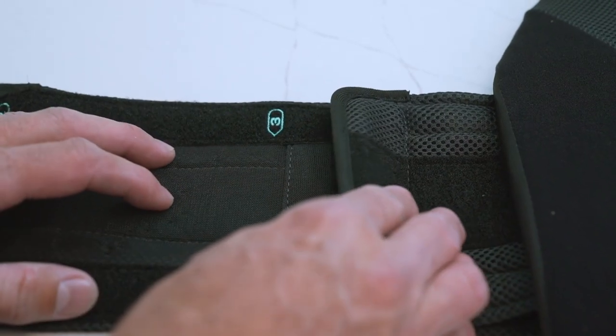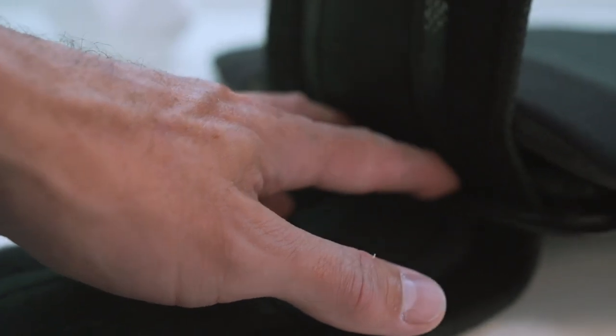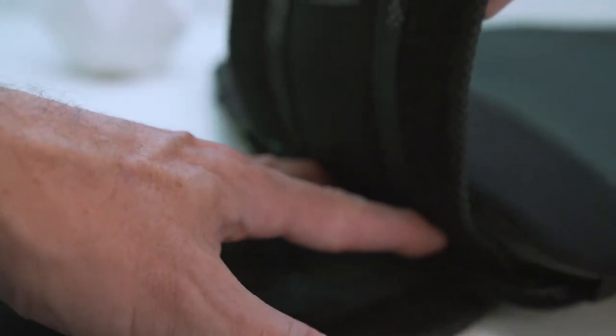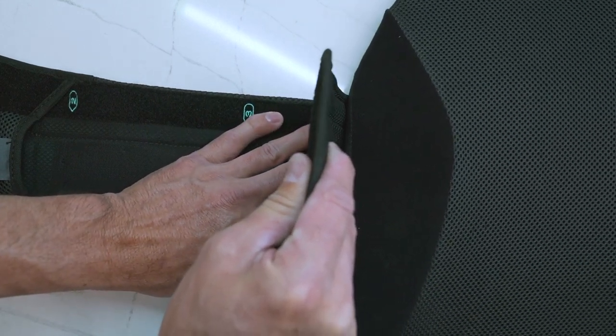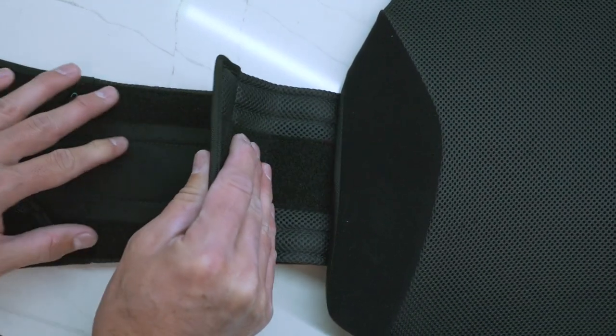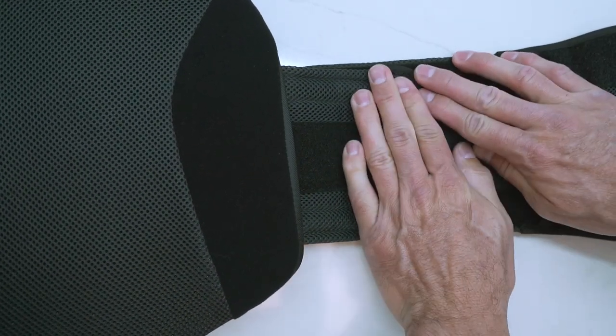Peel back the hook material from the folded-over end of the belt and free the fabric from the small molded hooks inside of the plastic slot. Now slide the belt toward the appropriate sizing number, press the end of the belt down to secure, and ensure both sides of the brace are adjusted equally.